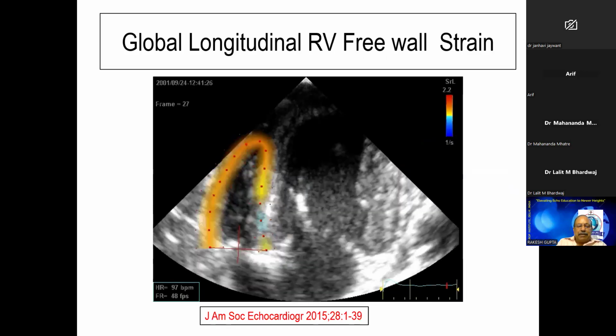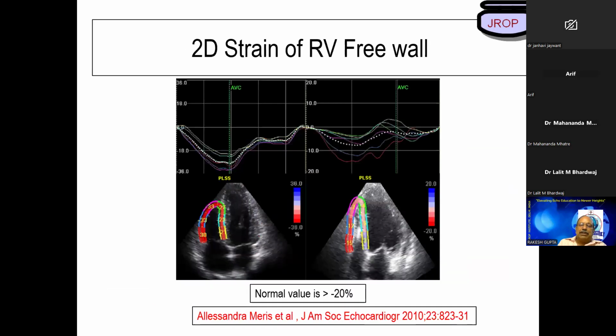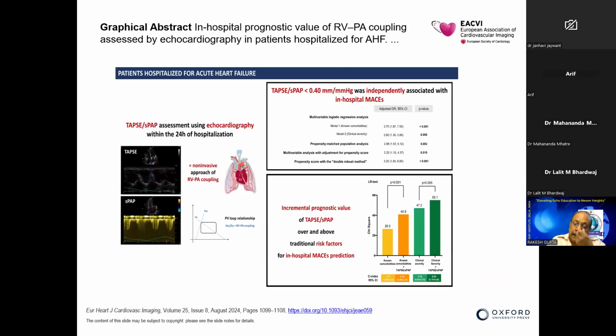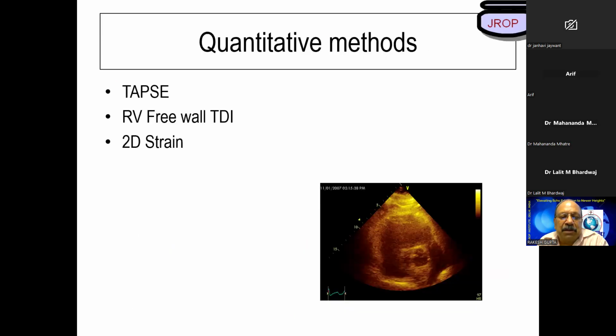And third, in pulmonary embolism, what will happen to the IVC? It will be huge, plethoric IVC. There is only one condition where the IVC could not be plethoric. Tell me, what is the condition where the IVC will not be plethoric?